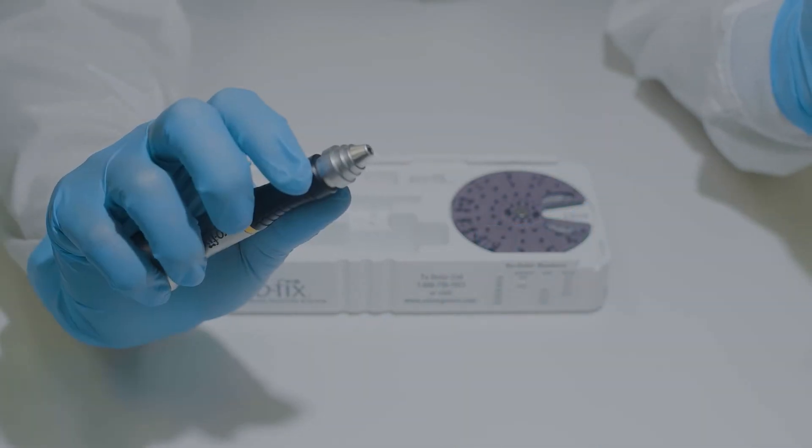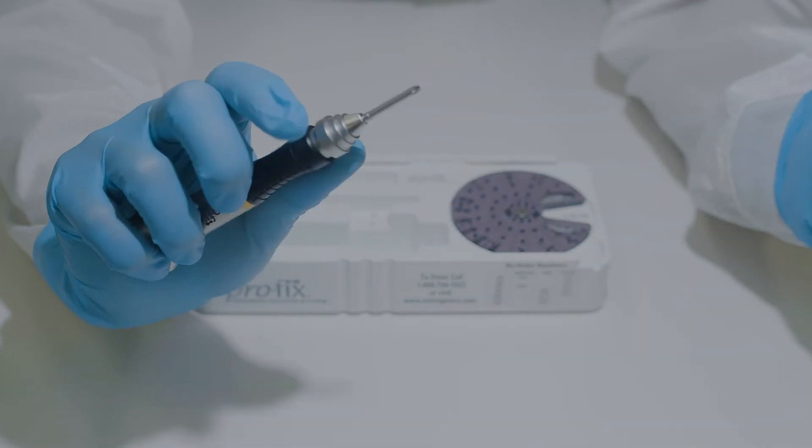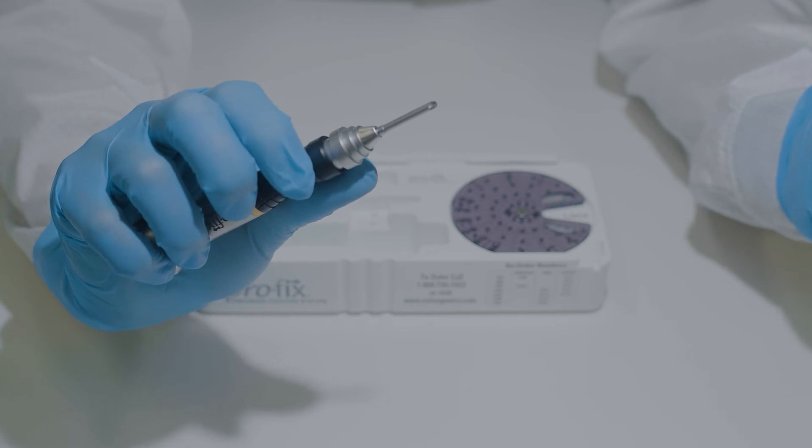In order to insert the blade, pull back the tiered collar, place the blade in the hole, and release the collar to lock the blade into place.